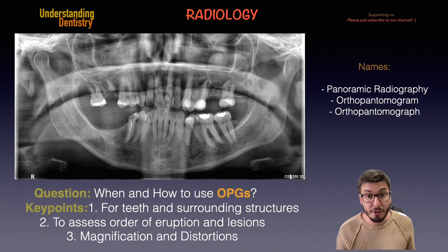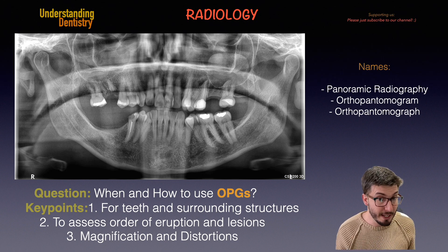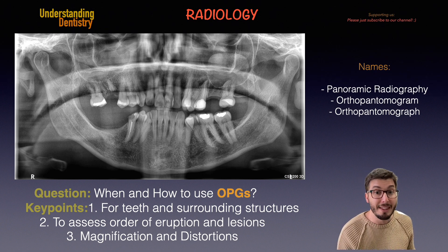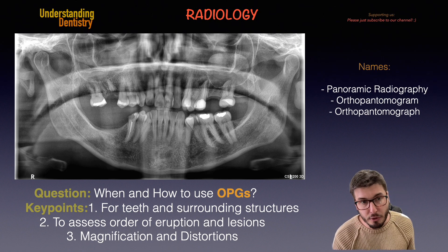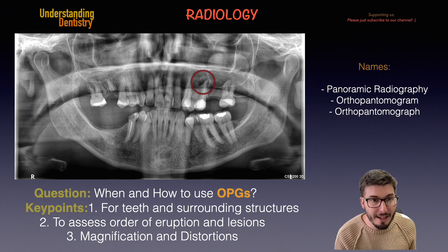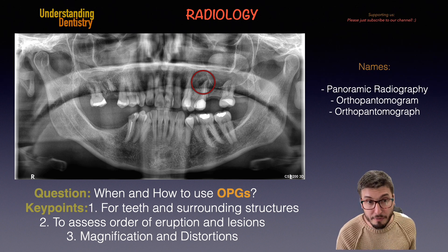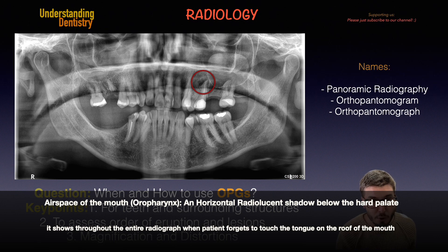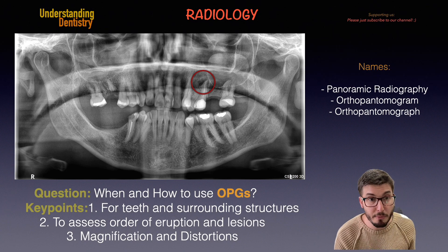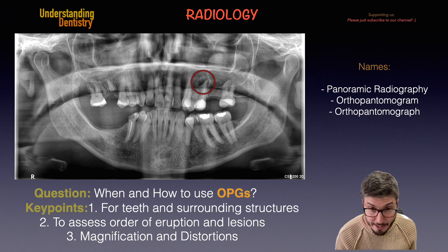The third key point is that we cannot forget about the fact that we have magnification and distortion with OPGs, and that's why we need periapical radiographs when we need more details. For example, we have this radiolucent image over here, which is suggestive of a granuloma with root resorption involved. But there is also a radiolucent shadow which belongs to the airspace of the mouth, being superimposed onto the lesion — and that's why we need a periapical radiograph to assess this area properly.